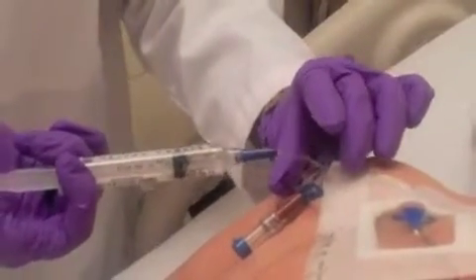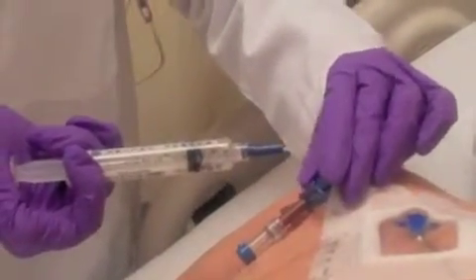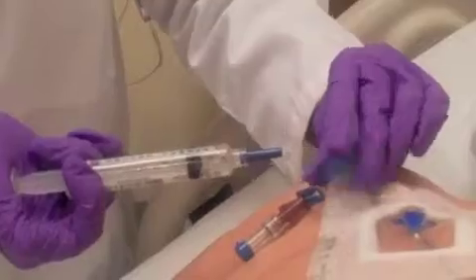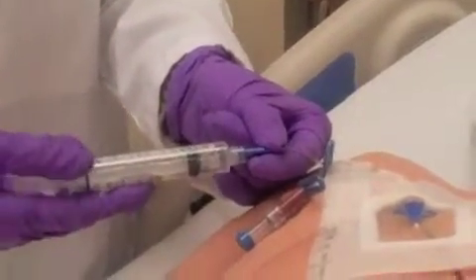Some hospitals call for the pulse pause technique, where you pulse the saline and then apply the clamp while you're pulsing, and this helps create friction in the line.